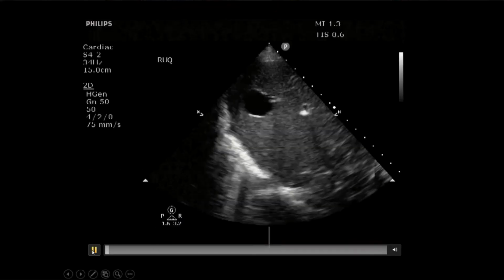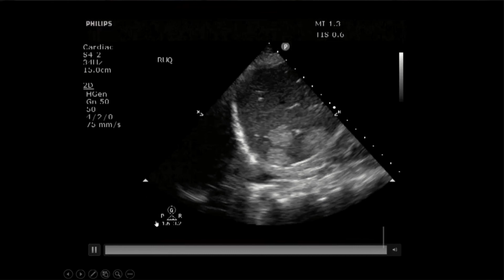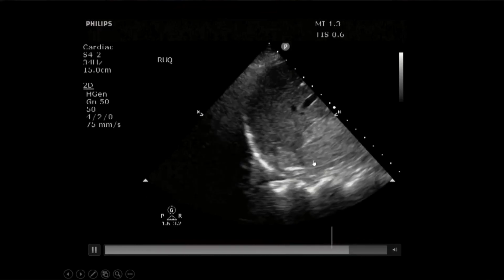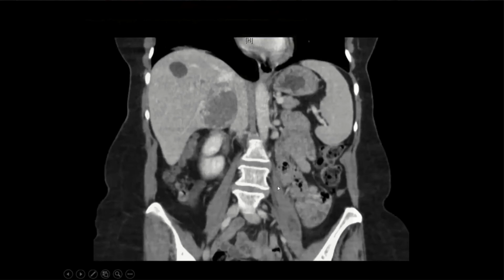scanning through it. And what's happening here? So we had a nice simple cyst at the beginning, and then we have these other lesions at the end. So now we have some solid lesions. So this is a great liver because it's got both simple cysts and solid lesions. So here's your cyst on your CT and your solid lesion.